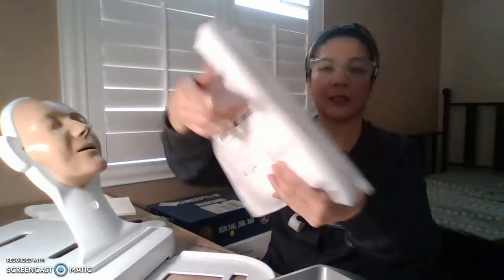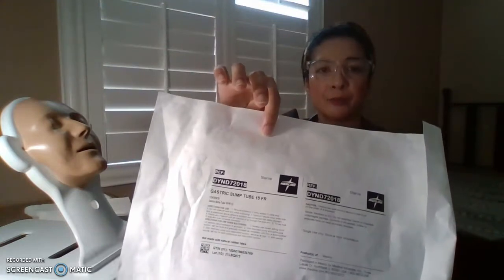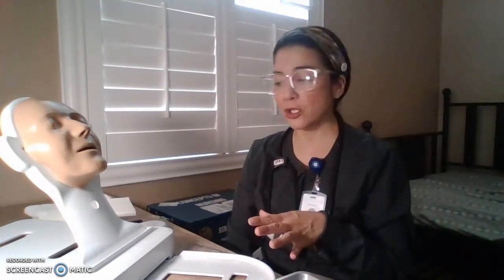Okay, make sure you take note of the size of the tubing that you'll be using depending on the patient that you will be working with, because you will have to document that size later on, before the procedure ends. Okay, so let's start. Let's say that you already confirmed the orders twice, patient's name, day-to-day procedure. So we're now going to go in the patient's room.